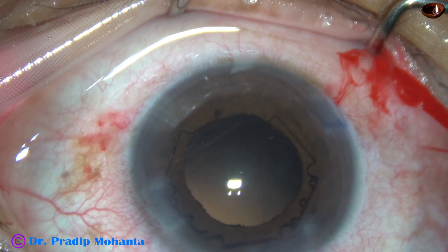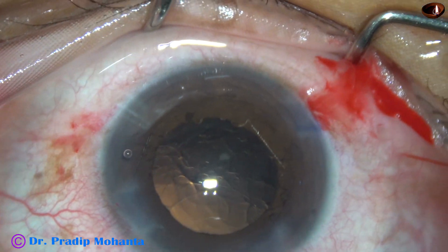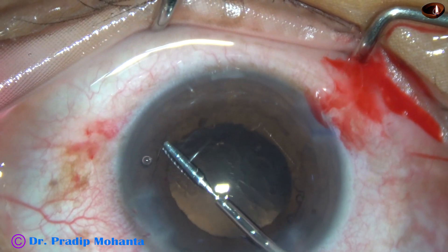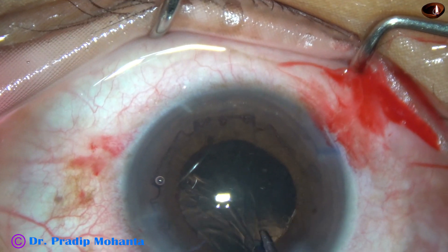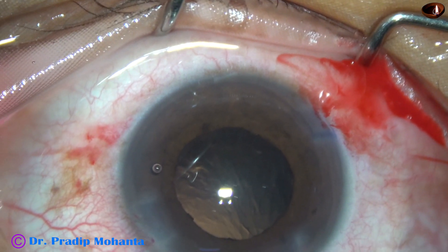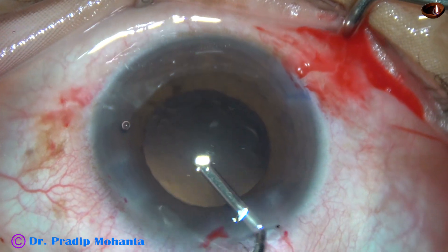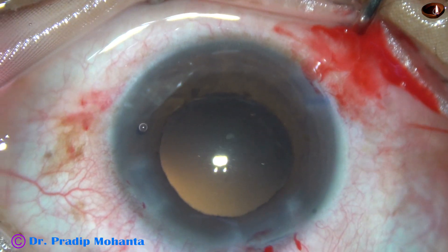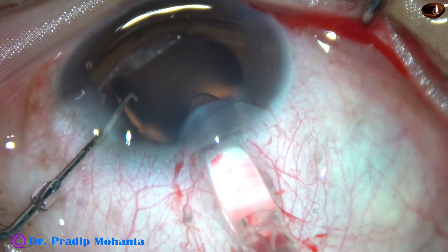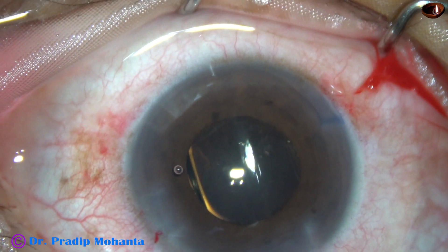And now I change hands and remove the cortex from 3 o'clock. At this time, I plan to remove the Bhex because it is not serving anymore. Probably we could have managed this case without the Bhex, but sometimes it happens — yes, we cannot judge accurately beforehand. And now I inject some more viscoelastic so that the pupil dilates a little more. And yes, it has dilated. I can see the rhexis margin now. And here goes the intraocular lens — this is a hydrophobic, monofocal, single-piece intraocular lens. And the lens has gone in the capsular bag.